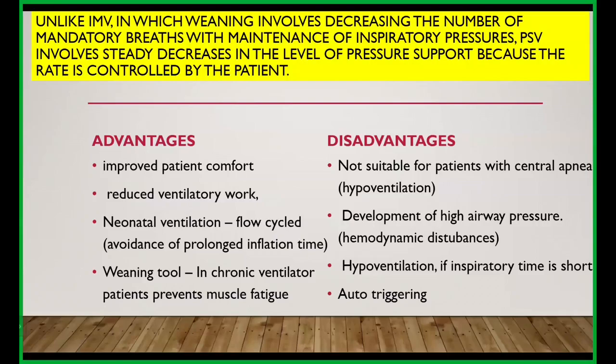Now, advantages. Pressure support ventilation, you will have an increased patient comfort. The ventilatory workload is minimized. It finds its place in your neonatal ventilation, that is due to the flow cycling. It is an efficient weaning.